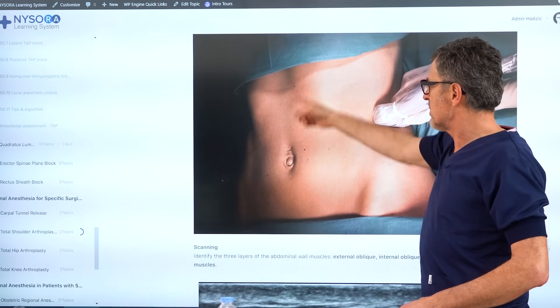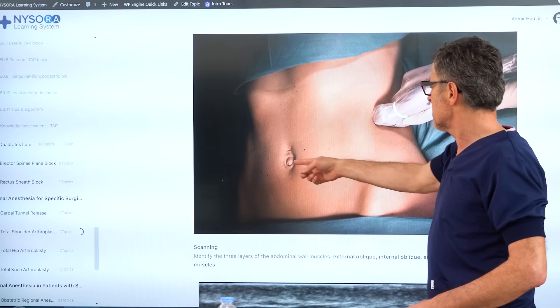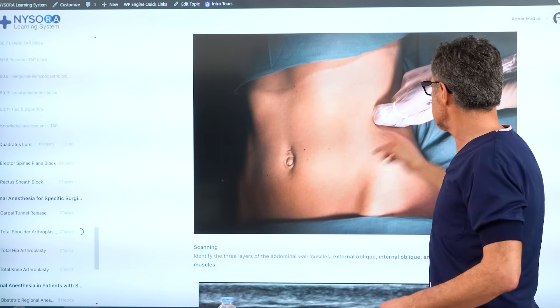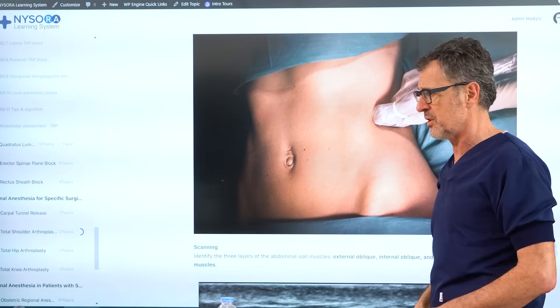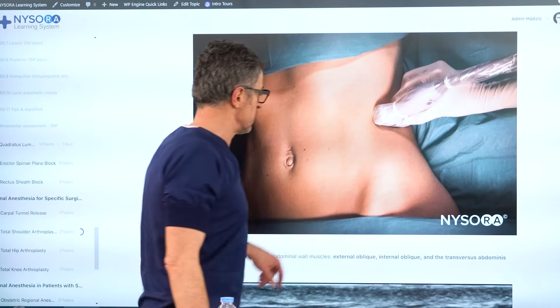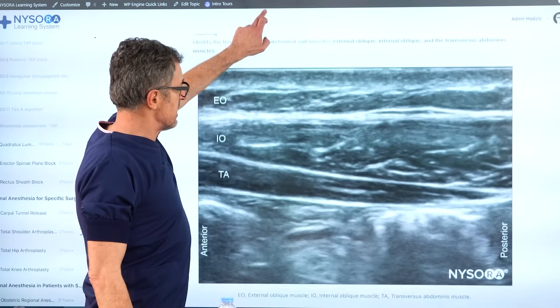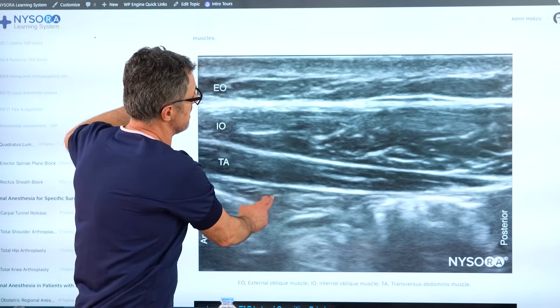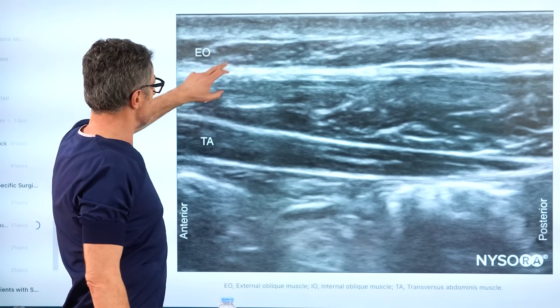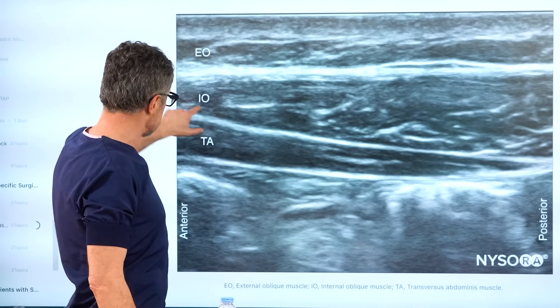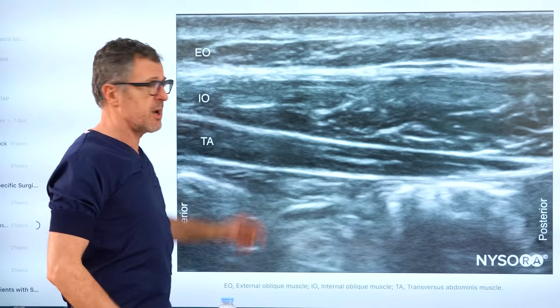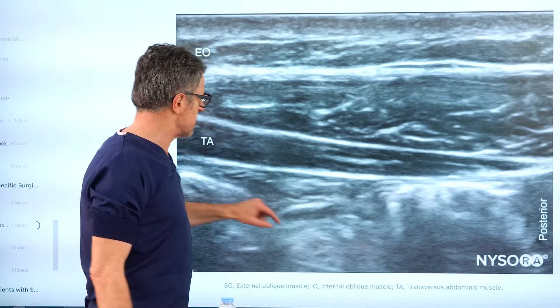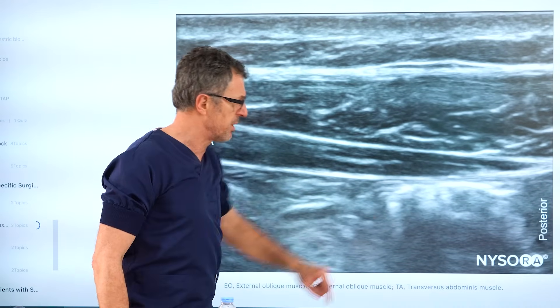That's the midline — you can see the abdomen and umbilicus. Here is the mid-axillary line, and the transducer is placed in the mid-axillary line in a transverse position. That's really where we get the best images for this technique. The image we want to reproduce shows the abdominal wall: the external oblique muscle, internal oblique muscle, transverse abdominus muscle, and the abdominal cavity with bowels inside and the parietal peritoneum.